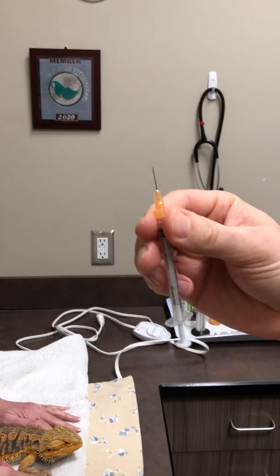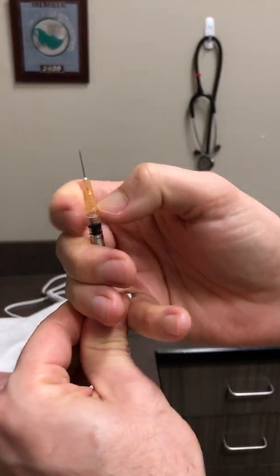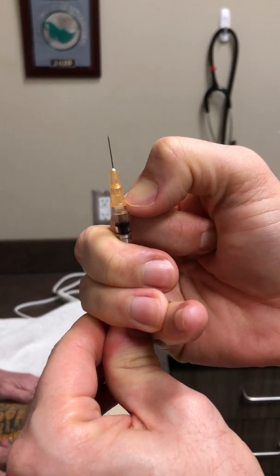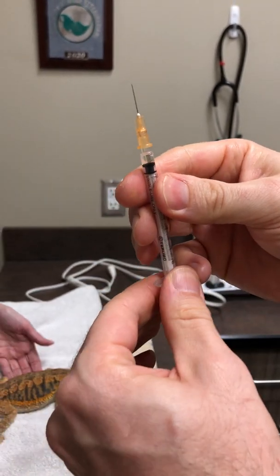Take off the lid to the needle. Make sure your needle is nicely attached — you can apply a little bit of firm pressure there. Probably safer to do this before taking the lid off, but just making sure that it's nicely pointed down.